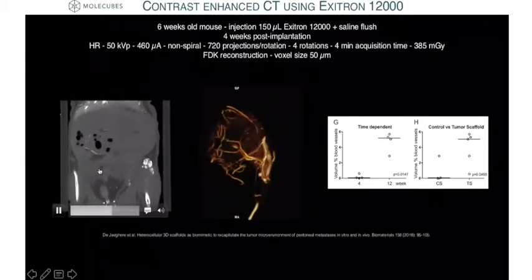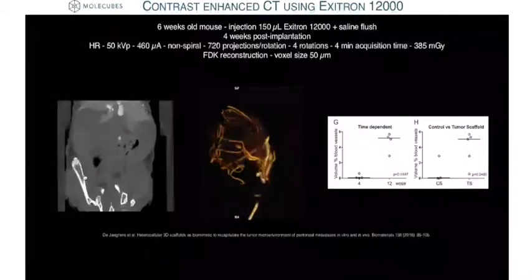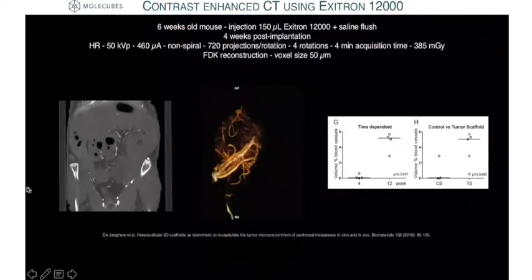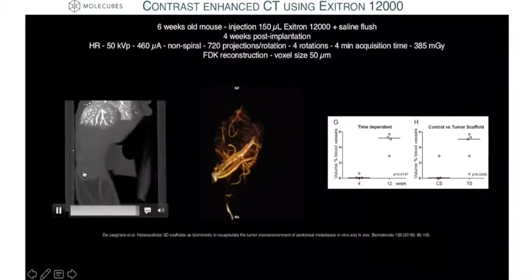Now on the contralateral side of this animal, there was also a scaffold, which you see here. And there they didn't load cancer cells, so it was a kind of control scaffold. And if you look very carefully here on the micro-CT scan, you'll see that there are, in fact, no blood vessels really running into the scaffolds.